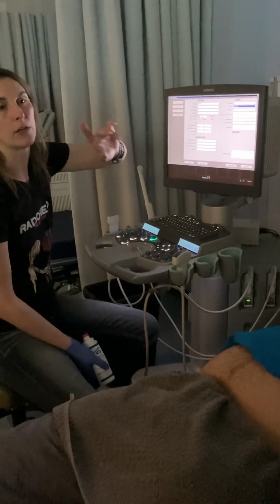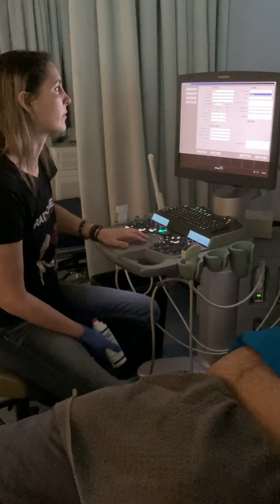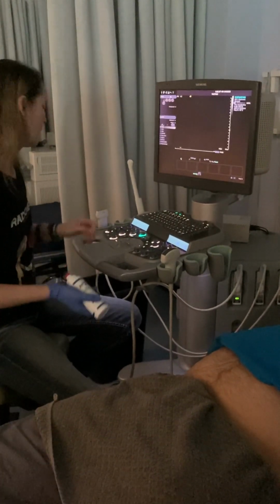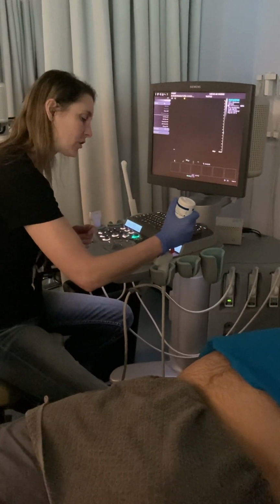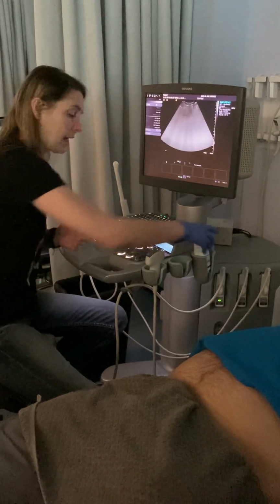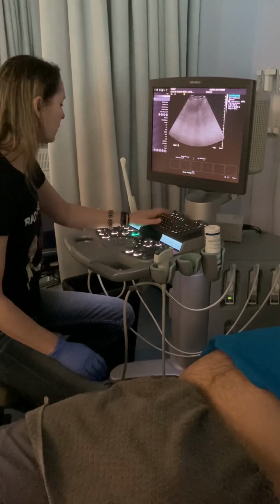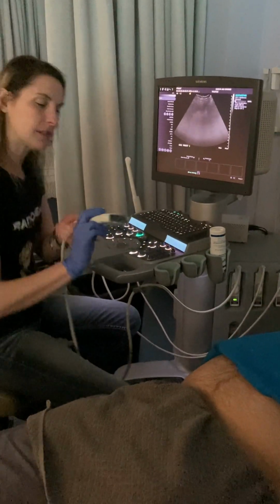Otherwise you can use the renal or the abdomen setting, because you'll be in a renal exam. But in this case, we have a prostate setting. Okay, so the prostate's location is going to be inferior posterior to the bladder, so it's very similar to where the vaginal canal is. So we're going to be down by that pubic symphysis again.